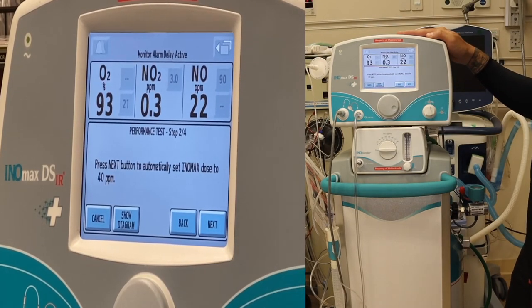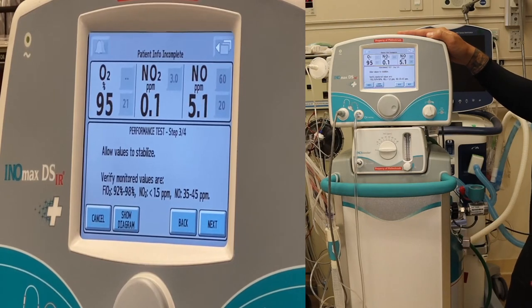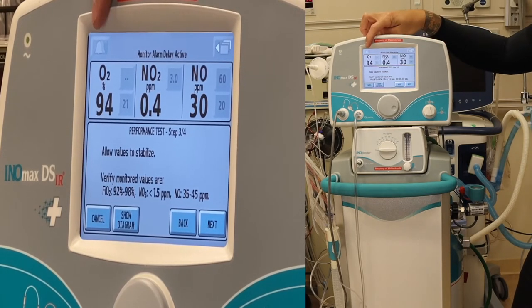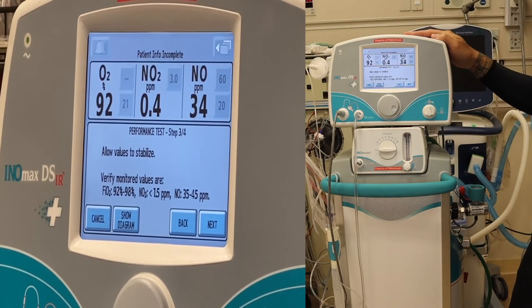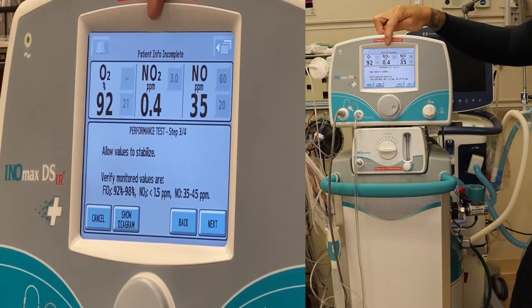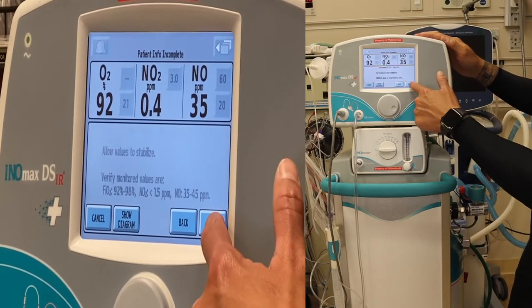Press next to automatically set the INO dose to 40 parts per million. Allow values to stabilize. Looking for FiO2 between 92 and 98%, nitric dioxide less than 1.5 parts per million, and nitric oxide 35 to 45 parts per million. FiO2 is good at 92, NO2 is good at less than 1.5, and NO is between 35 and 45. Next.